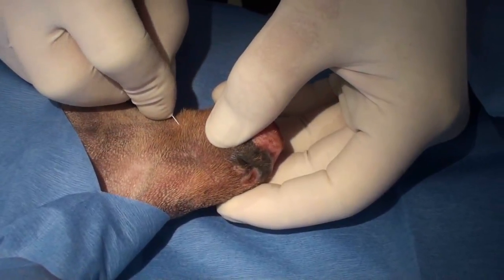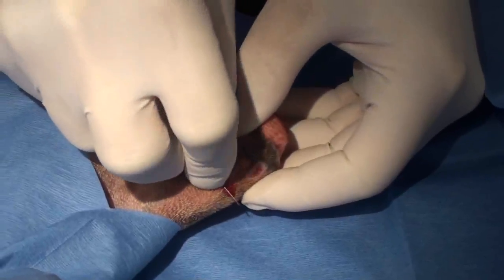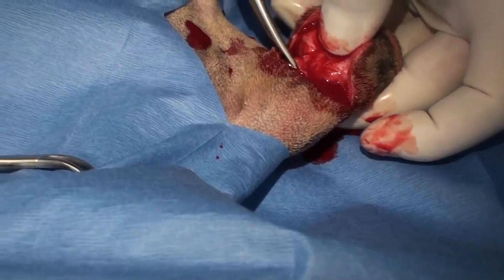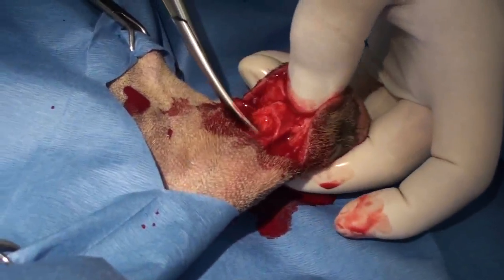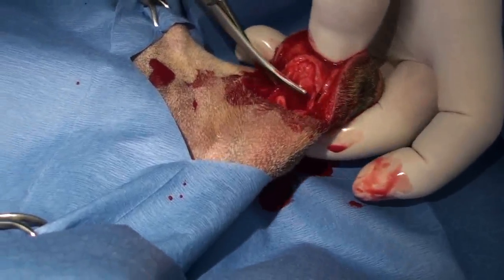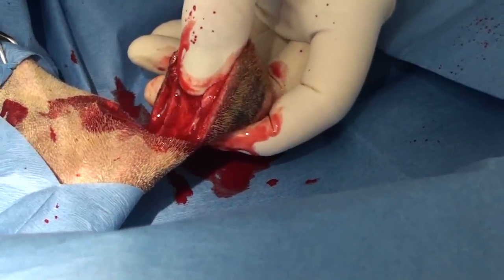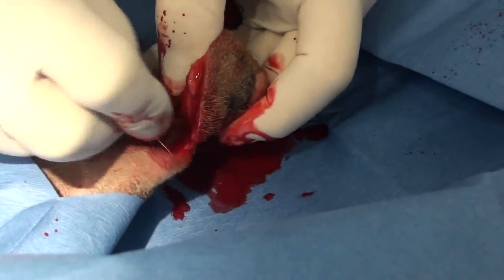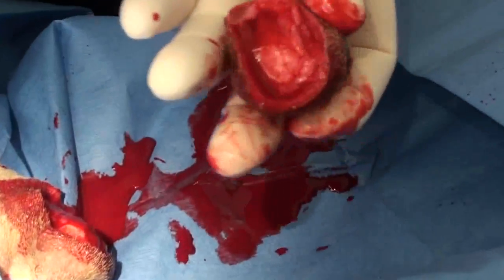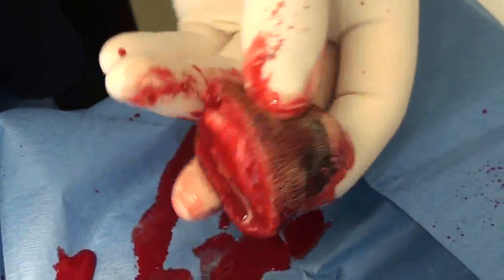To remove the hygroma, callus, or tumor, I'm going to incise the skin right by the hock at the bony part, then cut through the connective tissue joining the hock to the mass — the hygroma — and take the skin off on the other side. That leaves me with just the skin to close up. There's the callus inside the skin; it's a circular thing and you can see how it's ulcerated.